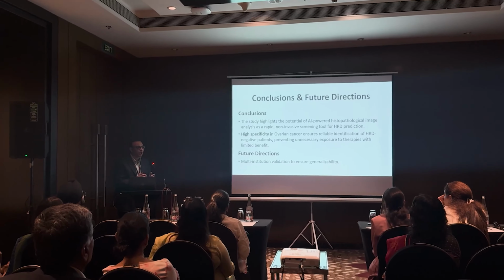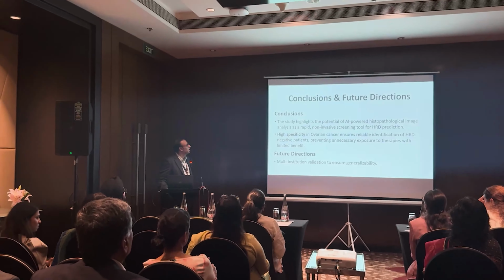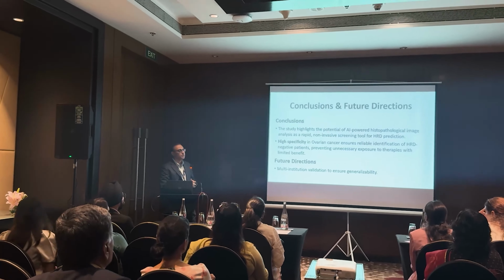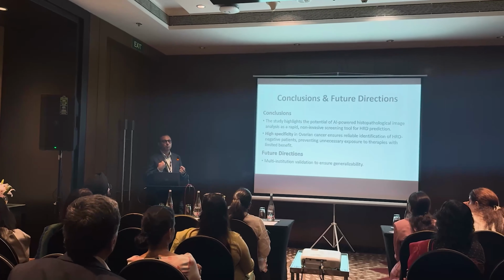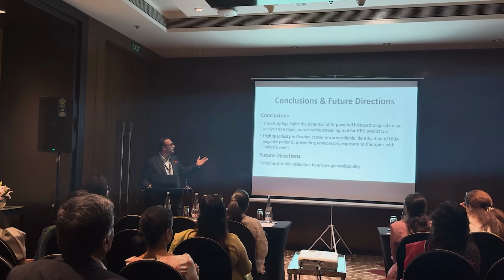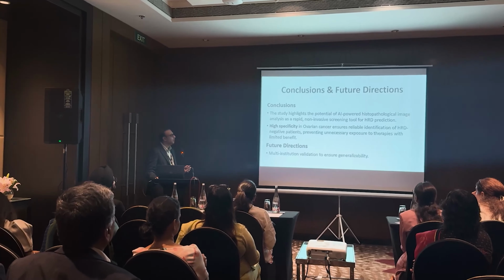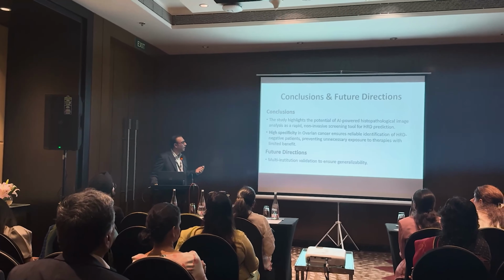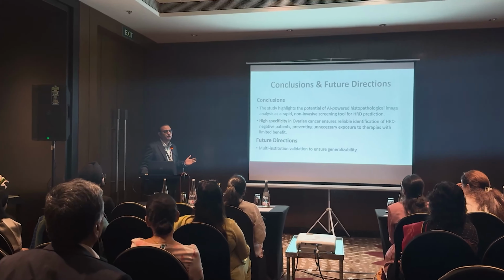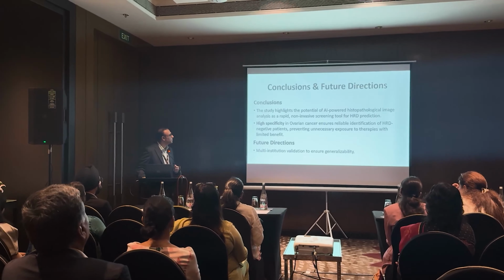For the conclusion, I want to be short because I know we are running out of time. We have designed an AI model that can potentially pick up these subtle biomarkers that are really important for HRD prediction. And looking at the higher specificity, we can clearly see that it can be used to rule out patients who do not need therapies like PARP inhibitor therapy.